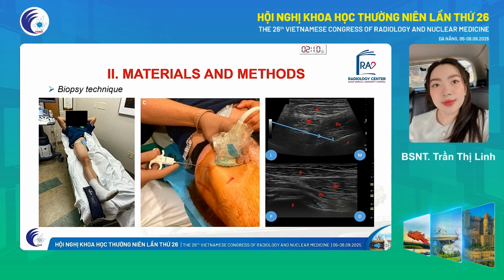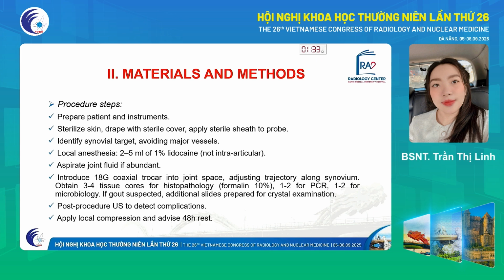And we can see the position: patient supine, hip neutral or slight external rotation, knee extended, needle approach from lateral to medial, just posterior to the sartorius muscle, directed toward the head-neck junction of the femur. And the equipment: sterile environment, the convex and linear probe. Biopsy was performed by radiologists with 7 to 10 years of ultrasound-guided interventional experience. The procedure was conducted step by step.